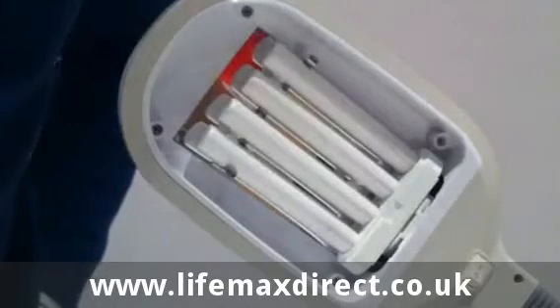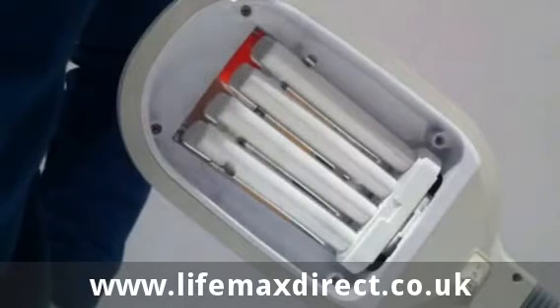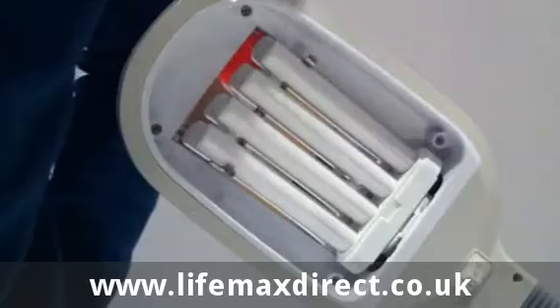Hi, today I'm going to show you how to safely remove and replace your bulb in your LIFE MAX 250 high vision lamp. First of all, ensure the lamp is unplugged from the mains and turned off.